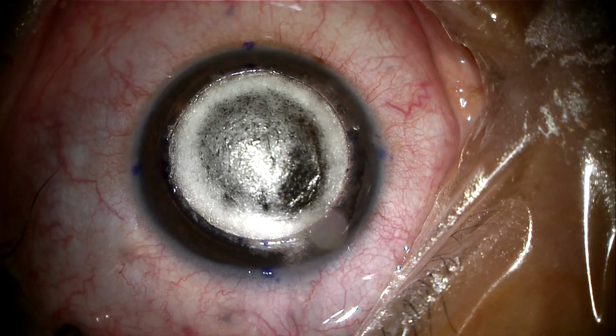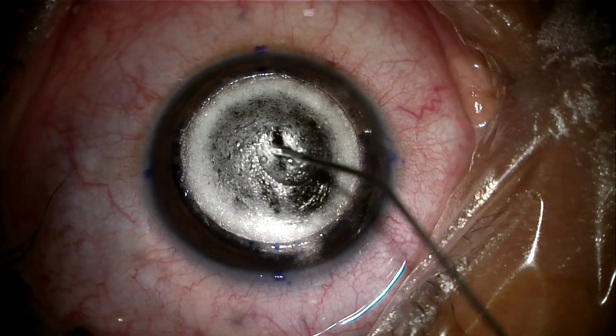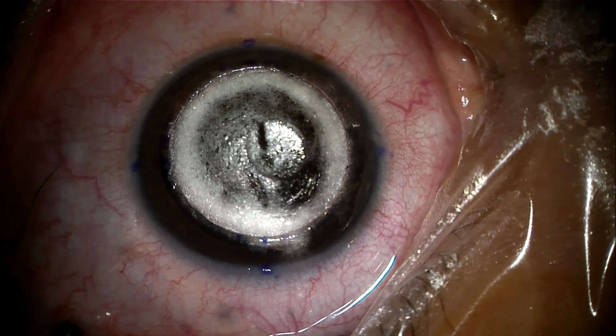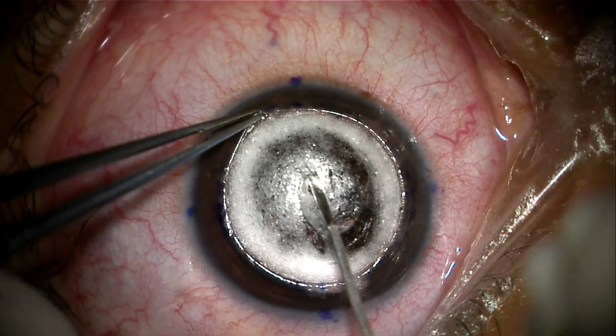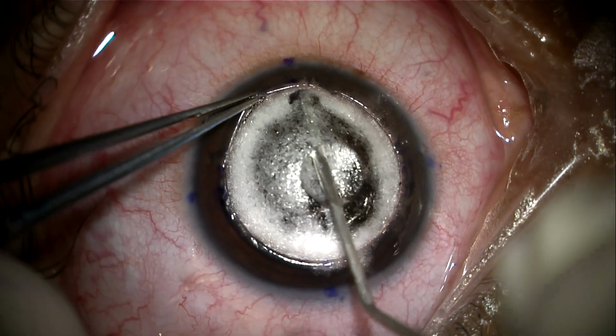Big bubble opening is a very critical step where the roof of the bubble is opened. The opening should be fast and effective to provide an adequate sized opening. To perform this, a paracentesis should ensure low pressure in the anterior chamber.